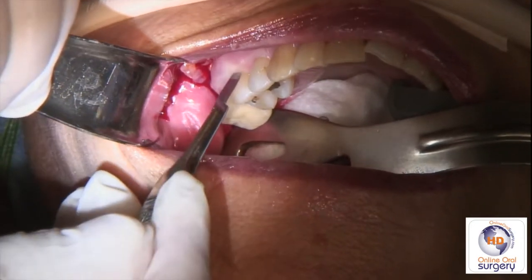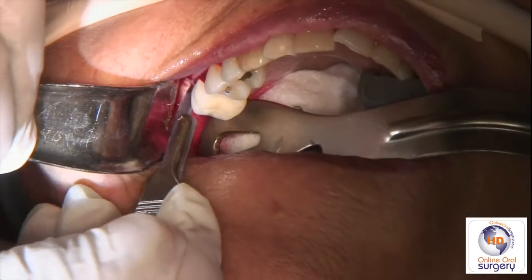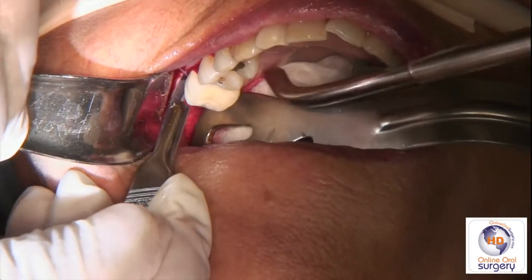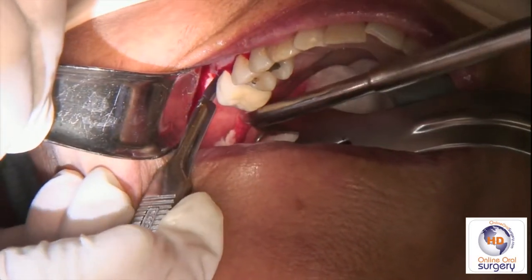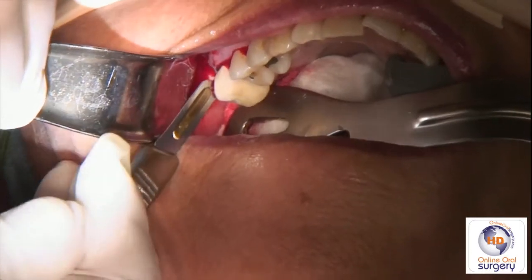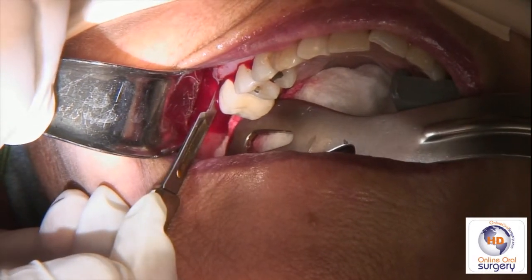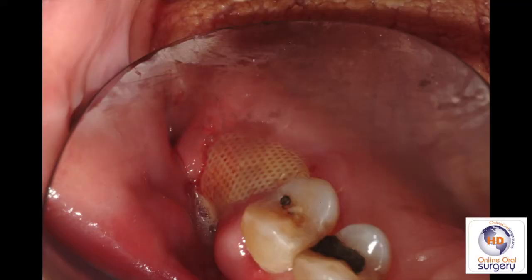We're going to start by making a sulcular incision between the first and second premolars — that's why we gave local that far anteriorly — then carry it into the sulcus distally, around tooth number three which we're going to be extracting, and then into the maxillary tuberosity region, because we're going to be elevating our flap and reflecting it back that far.